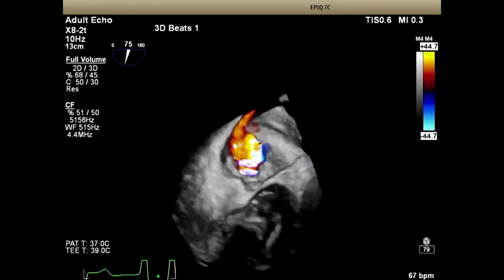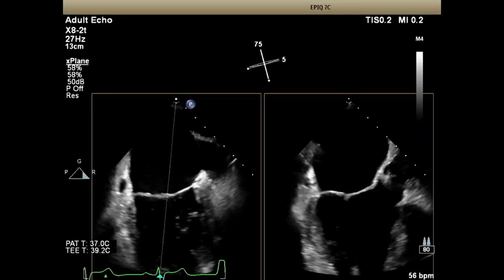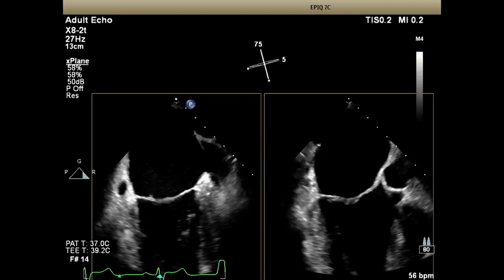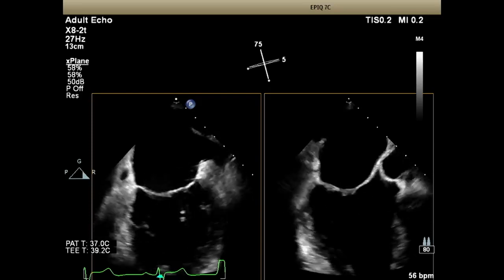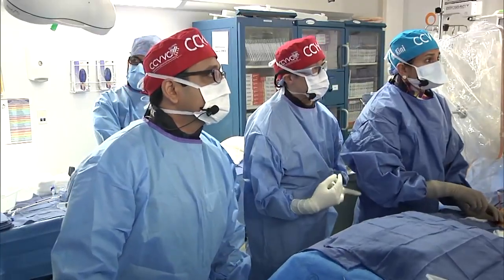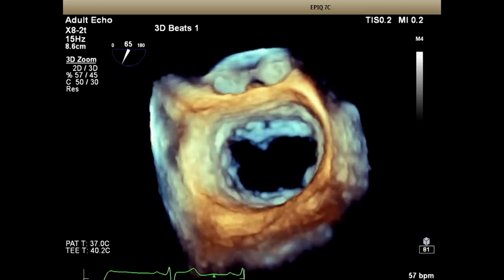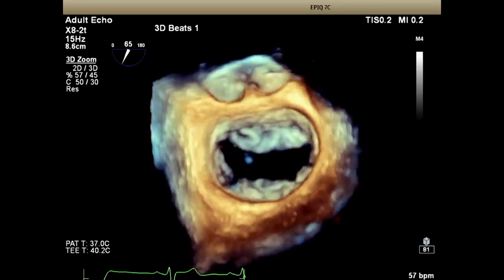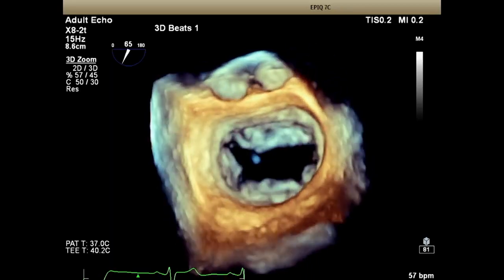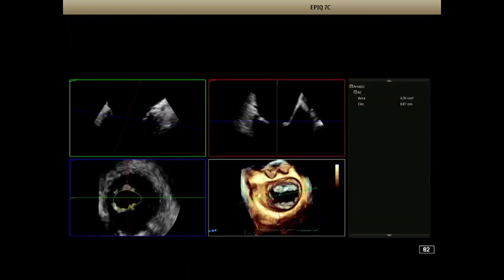We can see that also on the 3D image, we see a very wide jet right smack in the center of the mitral valve. This is an important view for us to look at when we're doing the clip. This is a commissural view on the left side, and an X-plane view. This is a perpendicular view to that, looking at the LVOT view, where we see exactly the A2, P2, and we can see exactly where we want to place our clip or two clips. When we look at it on 3D, this is important. This will become important later when we orient the clip arm. Also, the 3D helps make sure that we have adequate valve area before starting. Now we get the valve area, which is 4.4 in this case.